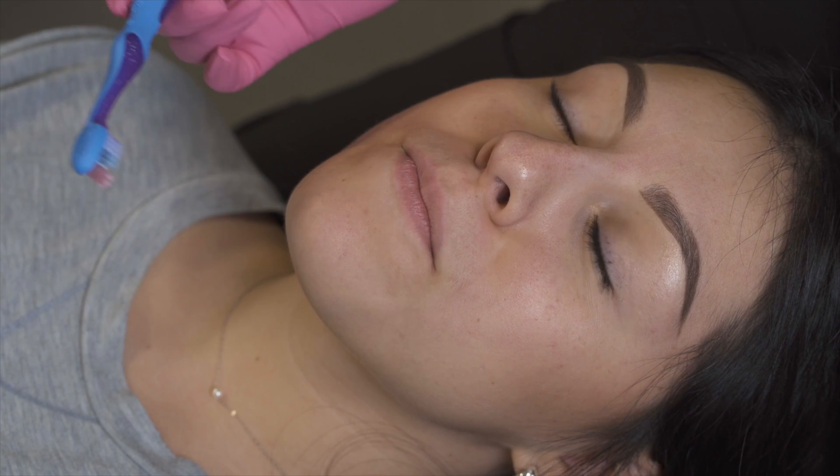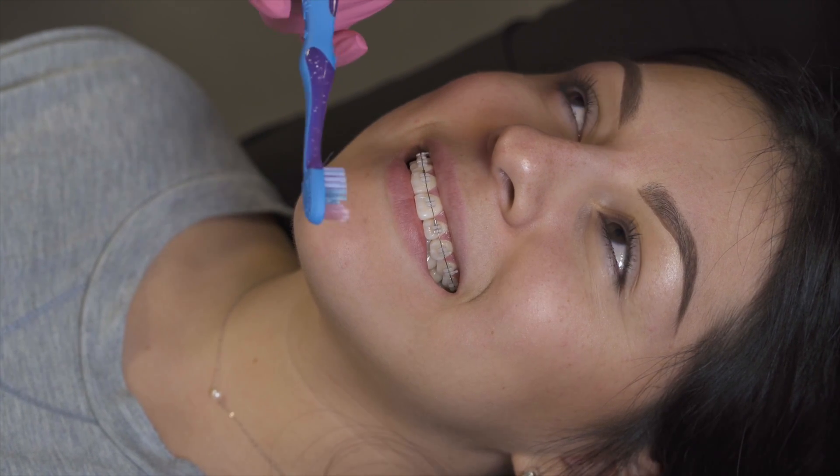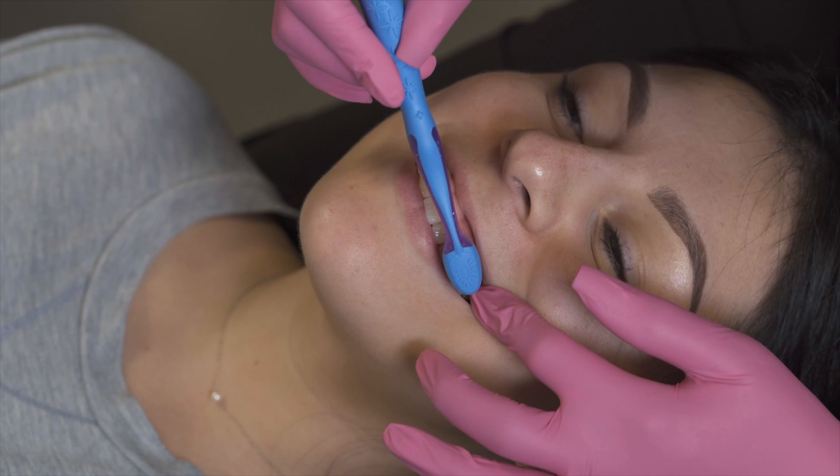We also recommend that you use a small kids toothbrush to get in between the areas that are more difficult to get to.